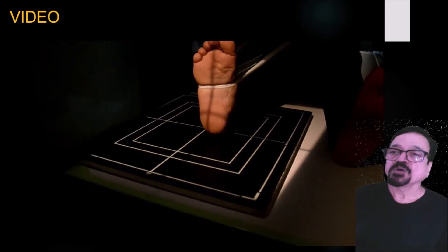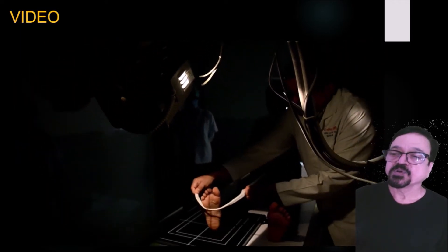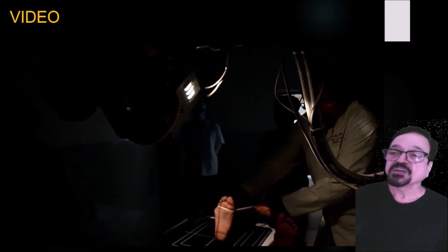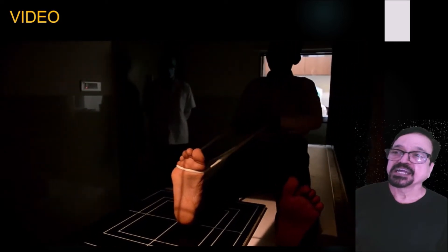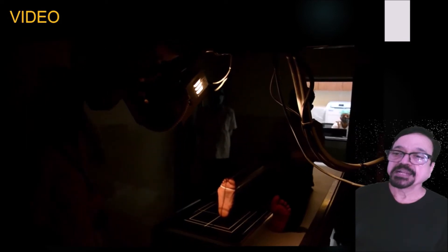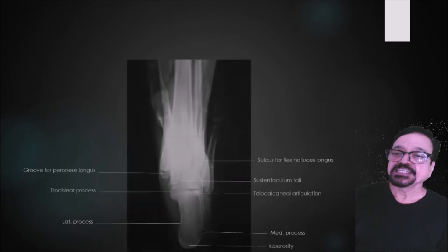You are seeing it. Can we modify it slightly better, or are there any other methods? We have to collimate the x-rays. Now we are trying to get more stretch. For that, you have to place the sling a little towards the distal end so that the flexion will be more and you will get a better calcaneal projection. This is important. It is a DR plate here, so you can have a good manipulation of the full calcaneus and the sling. It is easy since you are going to keep it over it.